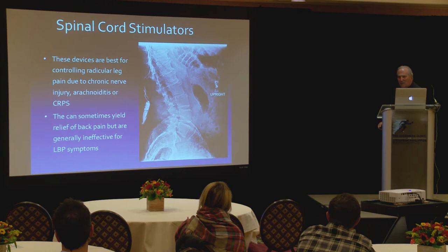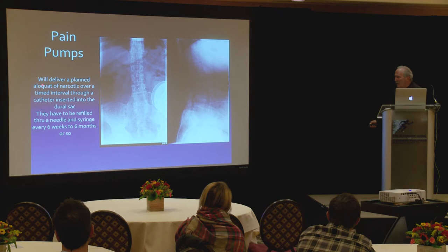And then finally, pain pumps. We'll deliver a planned aliquot of narcotic over a timed interval through a catheter inserted into the dural sac. So you have to take this catheter, it's inserted into the sac and it bathes the spine with narcotics.